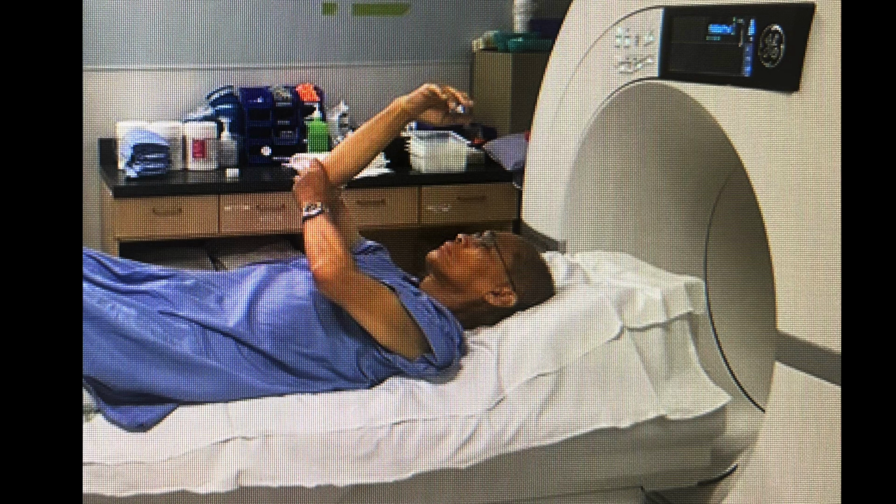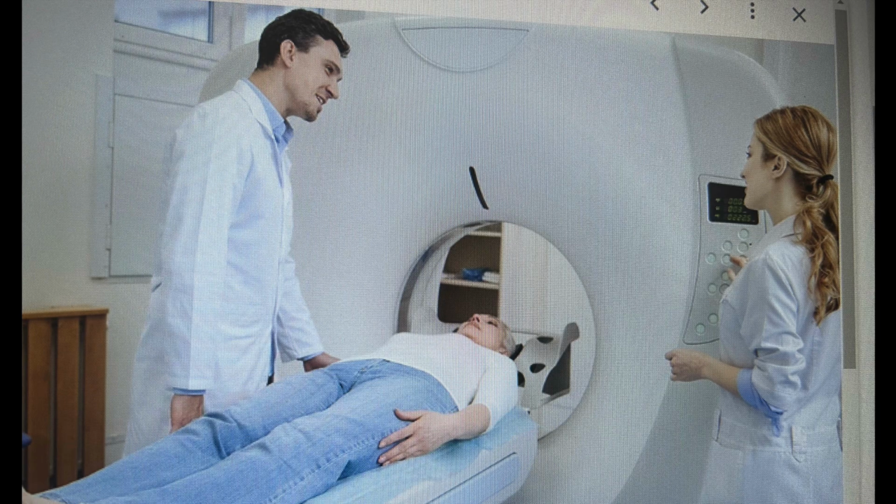When scanning shoulders, you should have your patient positioned like this on the table. Alright, I'm sorry, I couldn't help myself with that. Actually, the patient should be positioned like this, arm down by their side, thumb up towards the ceiling.